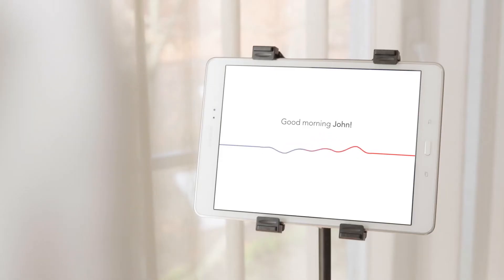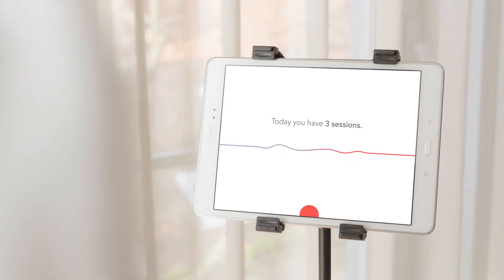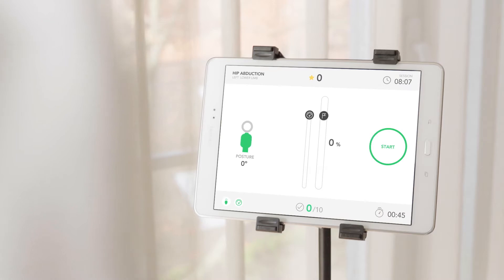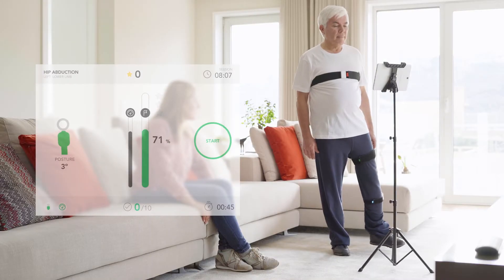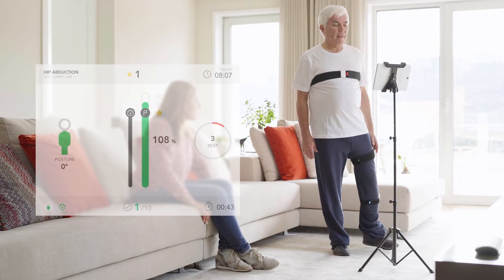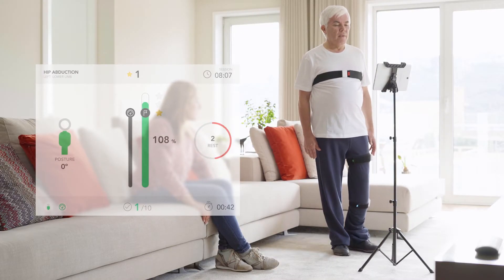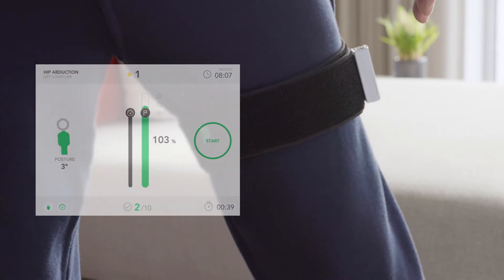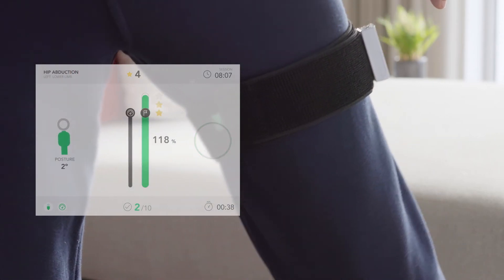Good morning, John. Today you have three sessions. And because everything happens at home, the patient is free to do his sessions whenever he wants, using small motion trackers to analyze each and every move.